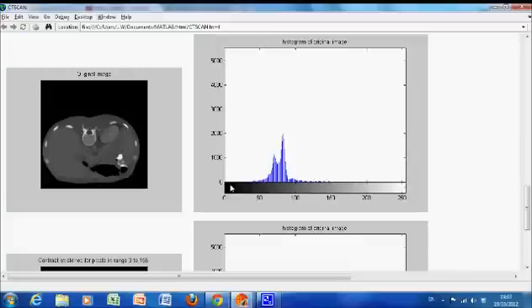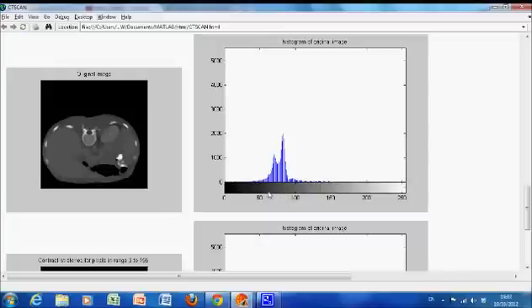So if we ignore the black, we can see that the image really starts somewhere around 10 or 5 grayscale values and it ends, the peak is around 150, 155. So what I decided to do was we want to do a contrast stretch for pixels from 5 to 155.